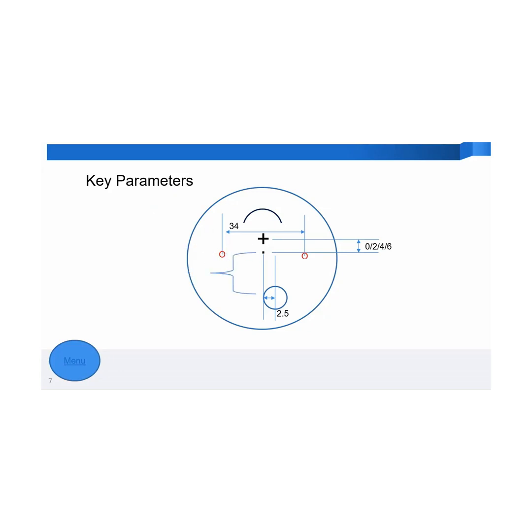One more important parameter is your corridor. Generally, the progressive corridor includes about 40% of the near circle, which is the minimum fitting height. And if you ask about the pure corridor, then it is from the place where the power starts till the top of the reading circle. Corridor, as you know, can be a short corridor or a regular corridor.